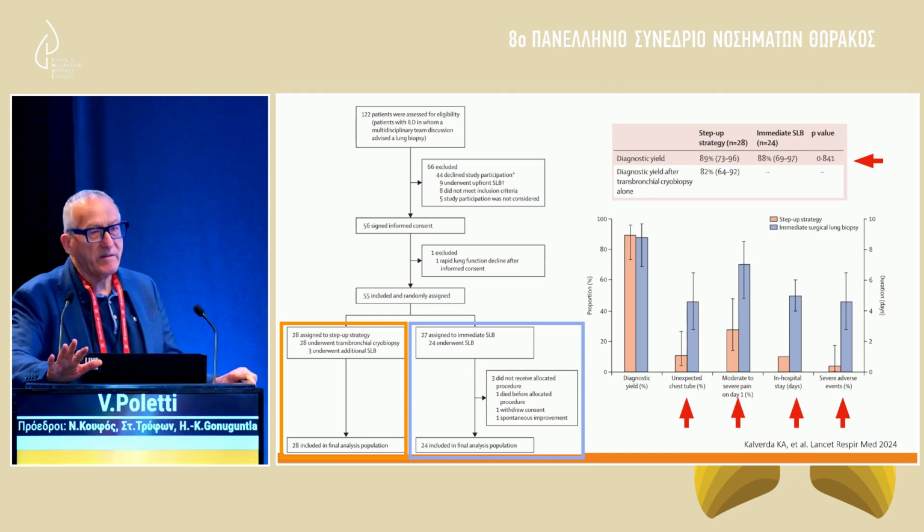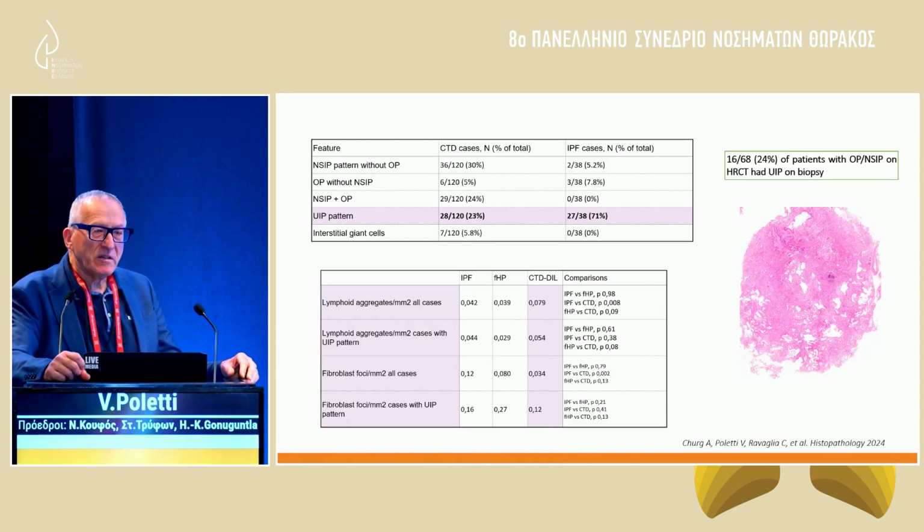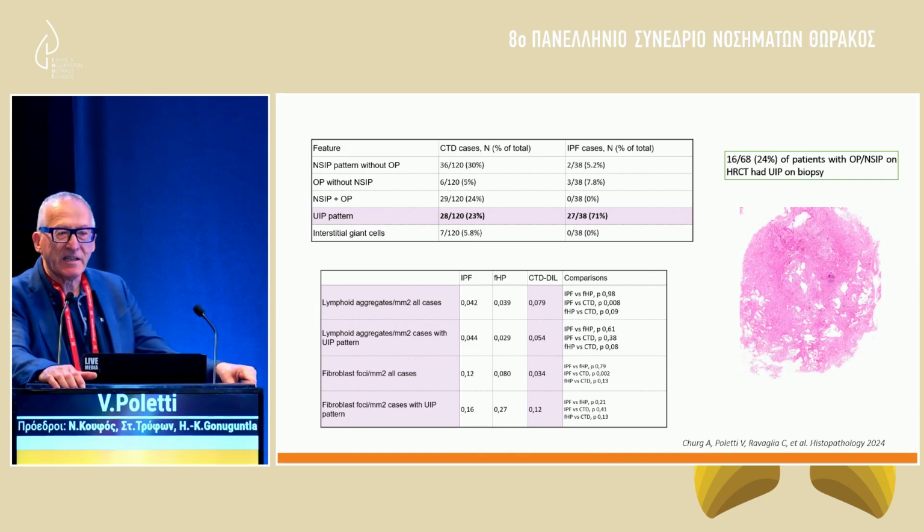So when first? Even if the guidelines say that, for example, in CTD-ILD you don't need histology, this is still a debatable approach.